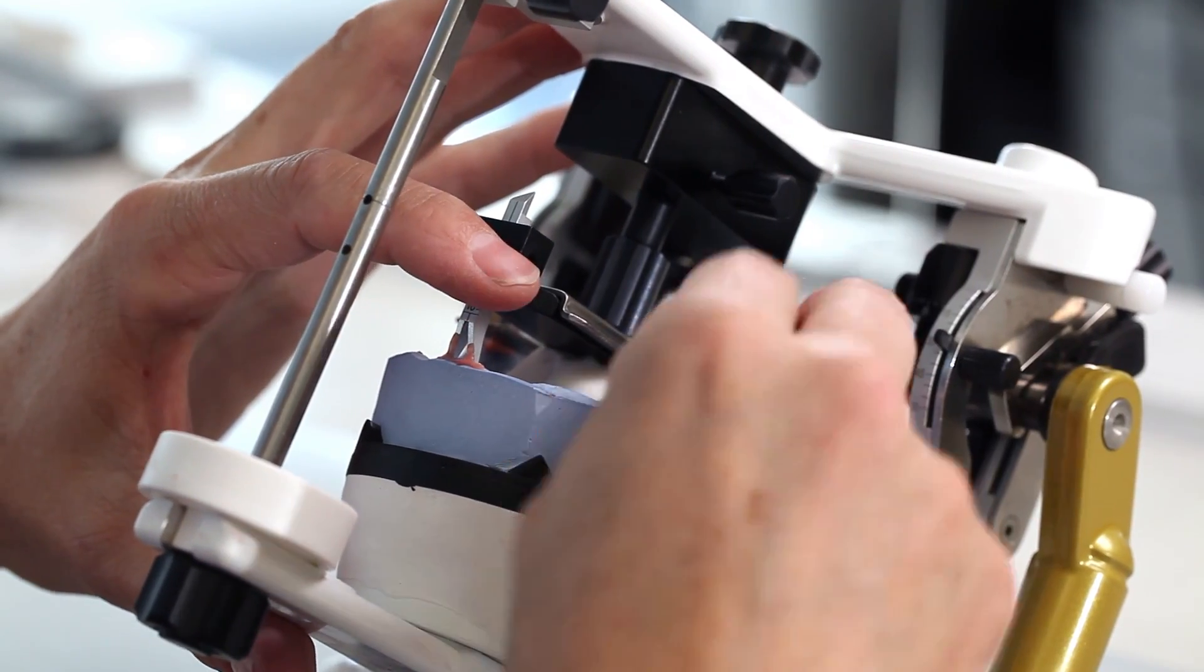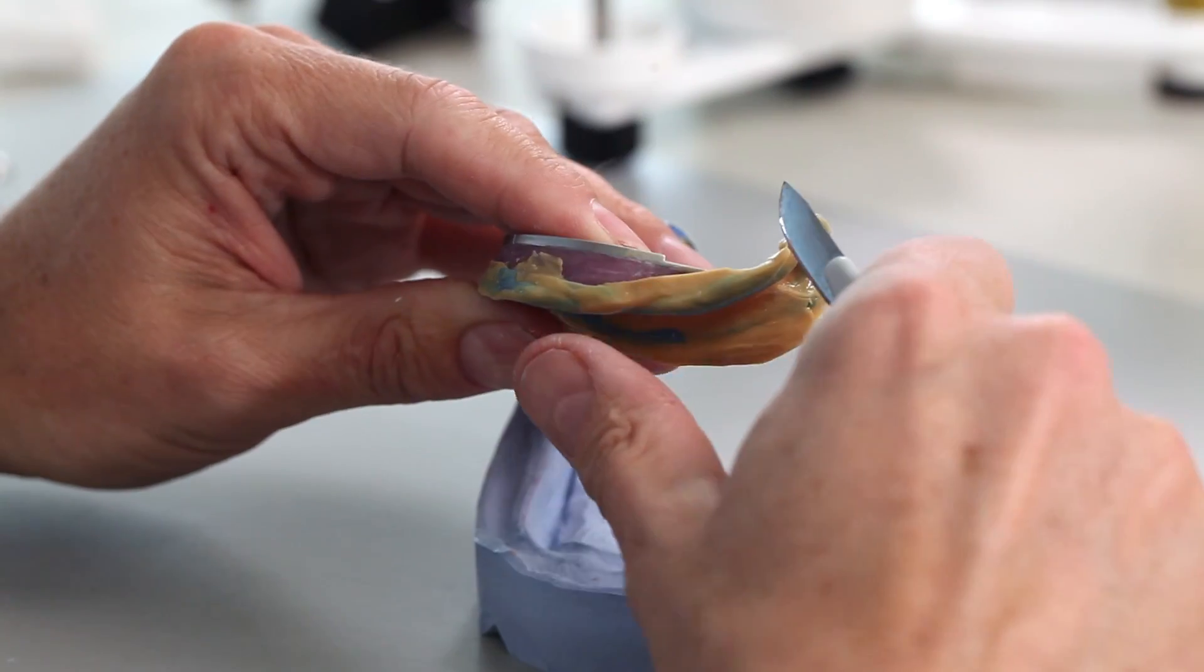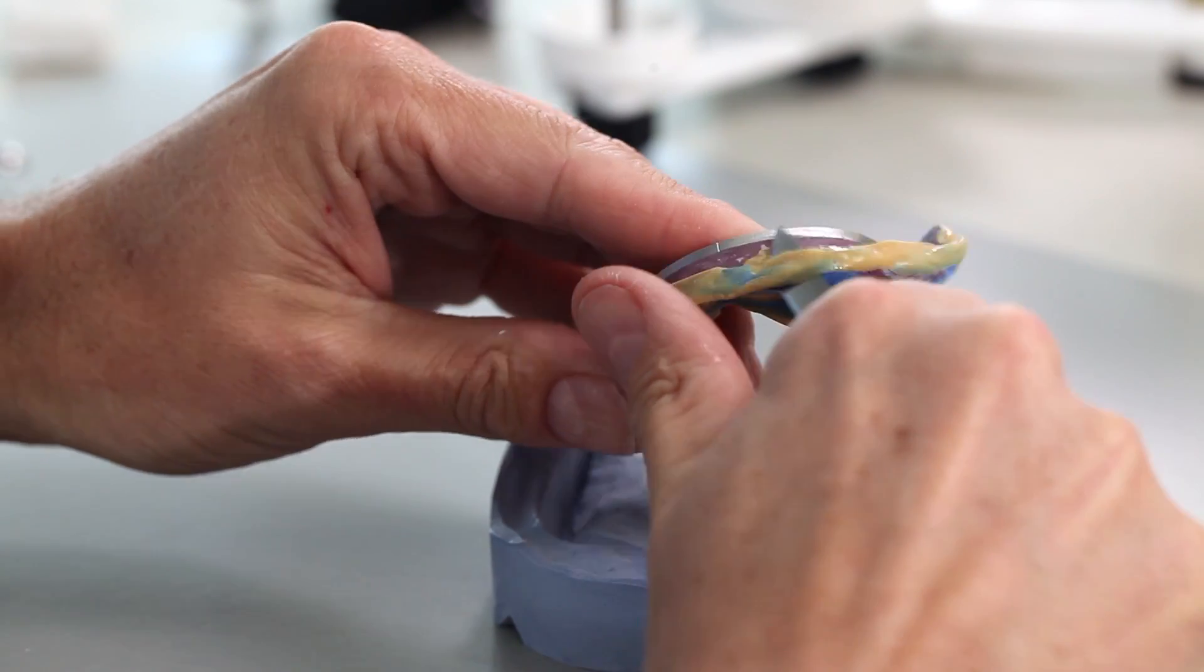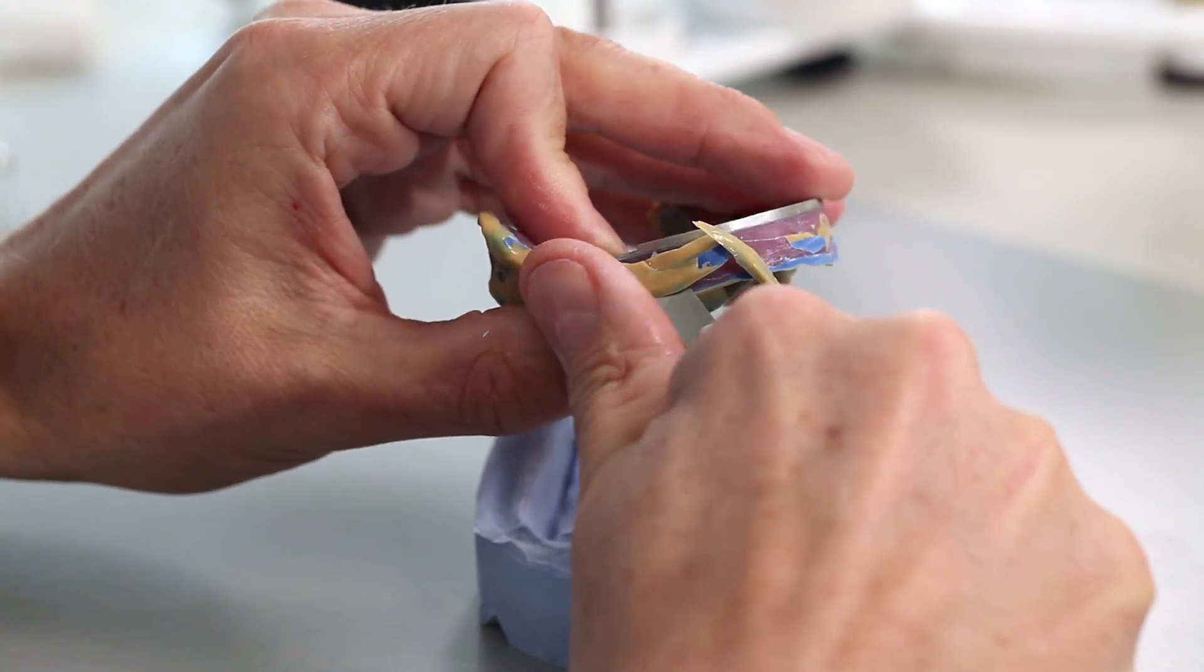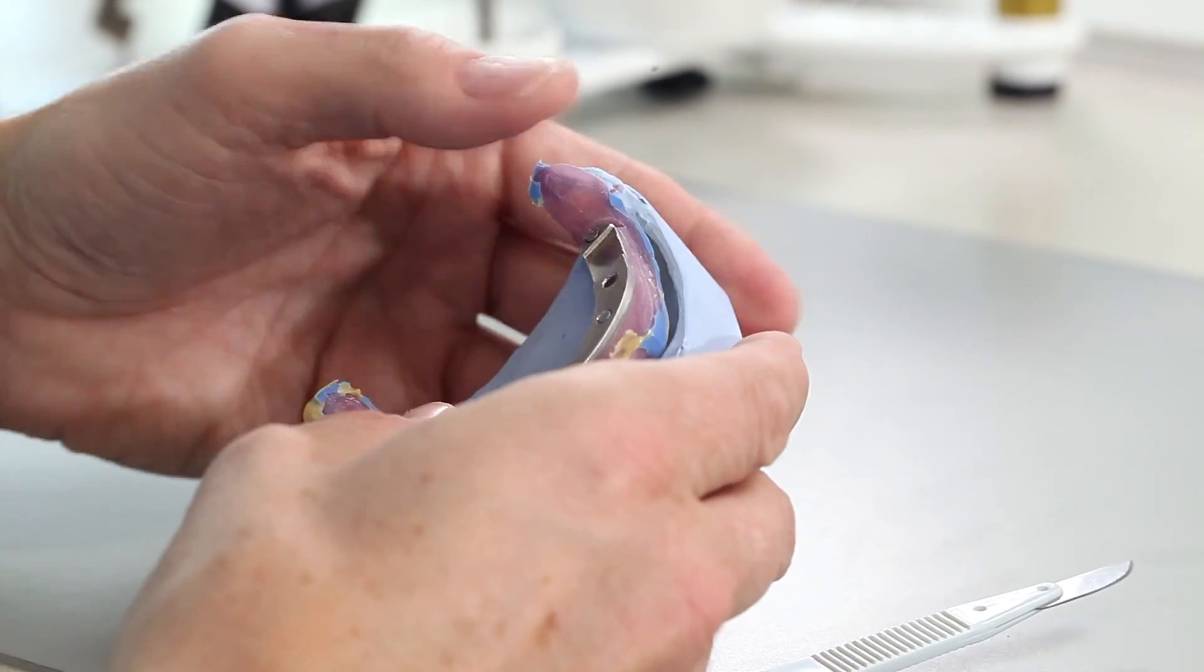Then, cautiously remove the horizontal guide and clean the mandibular model. Cut back the functional impression of the lower jaw on the vestibular side. Check whether it closely fits the model.